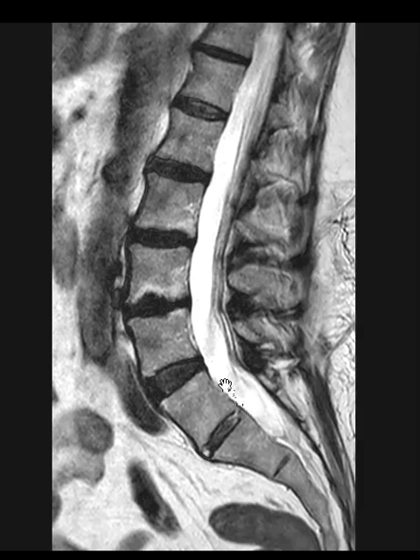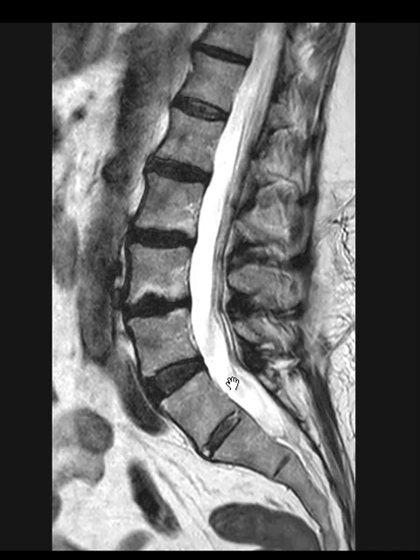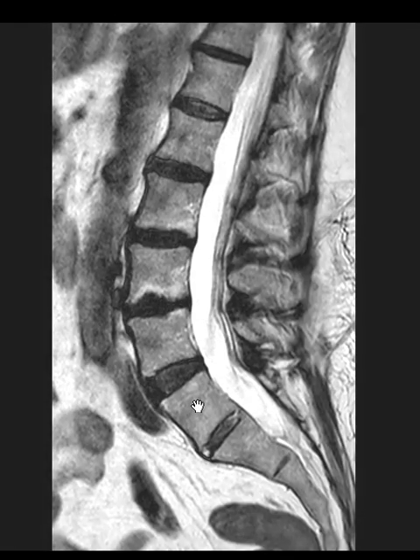So we say this is a transitional vertebral segment at the lumbar sacral junction, and sometimes we'll say this has been arbitrarily designated as an S1 vertebral body that is partially lumbarized, which means it looks square rather than cone-shaped. A very common finding — one radiologist may say this is an S1 vertebral body that is partially lumbarized and this is L5-S1.